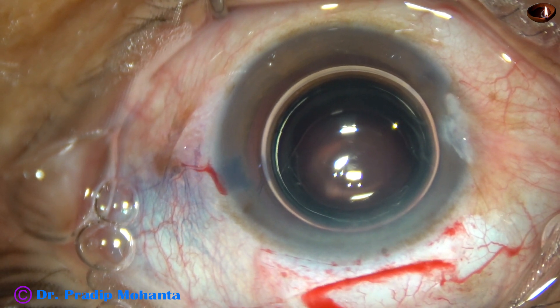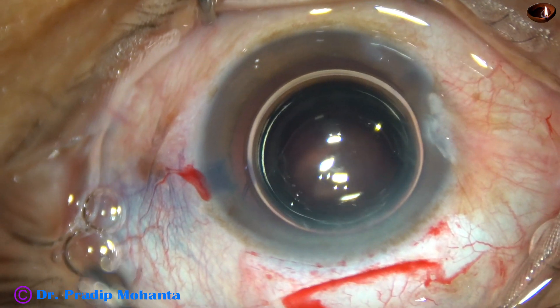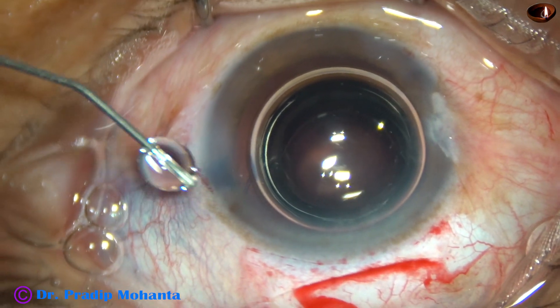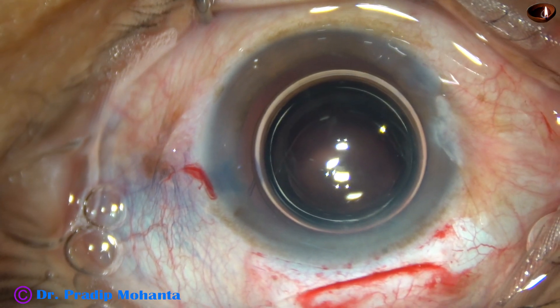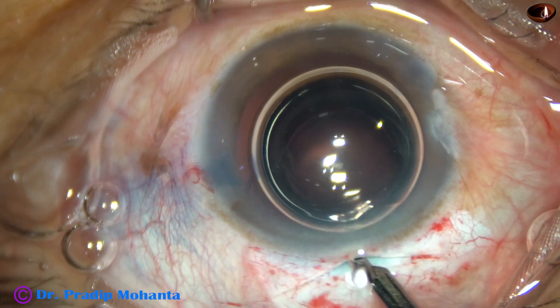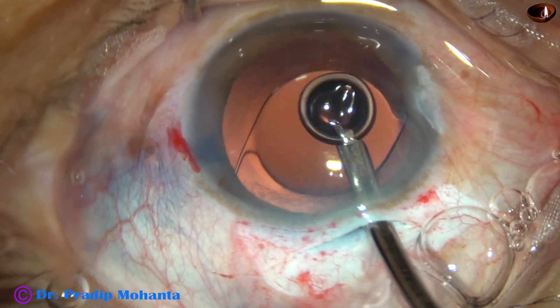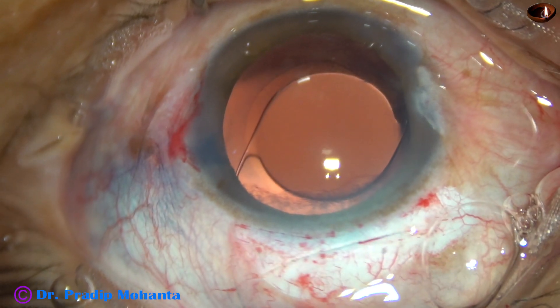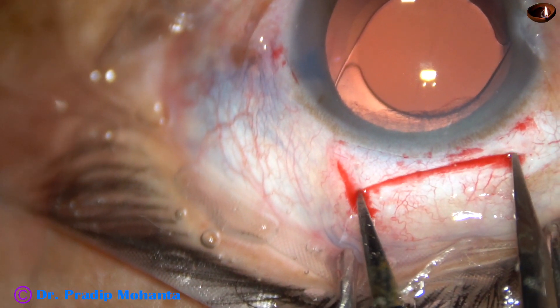And now I am closing the side ports by hydrating the corneal stroma on either side of the stab incisions — hydrate on the scleral side of the stab incisions, not the corneal side. Inject fluid on the scleral side of these side ports. And now this is the final lavage of the anterior chamber — this is how you form the anterior chamber very nicely and come out. Don't go into the eye. This is 7 mm — see the size of the wound.